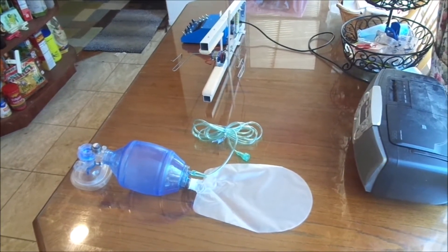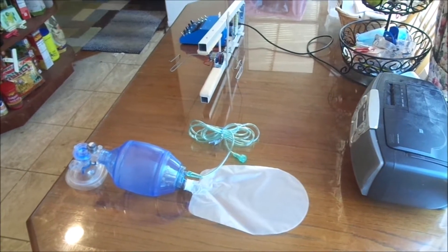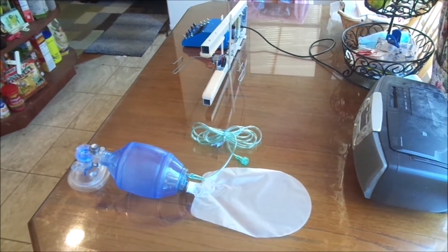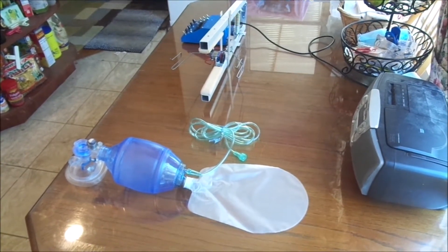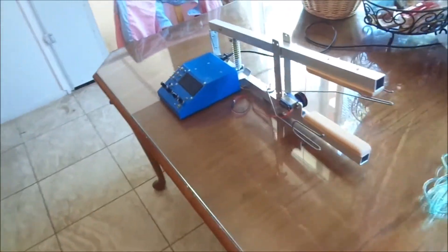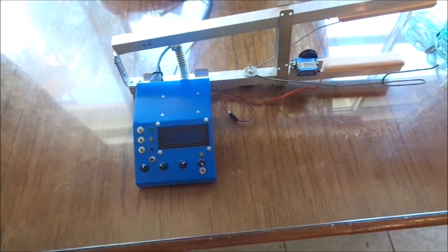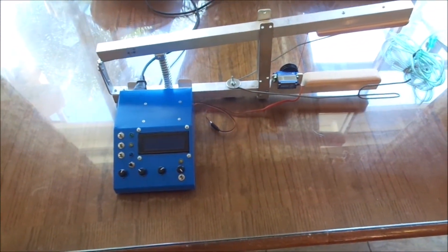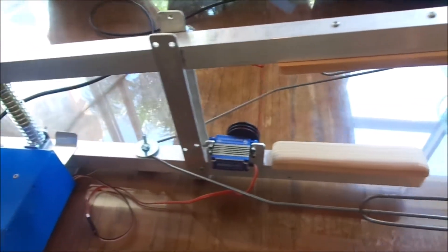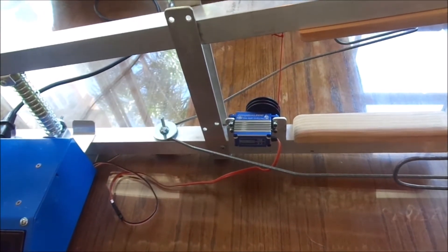There's the BVM unit — bag valve mask, or ambu bag. The mechanism squeezes the ambu bag at different rates, whatever you'd like to program it for. The doctor pretty much decides that. It operates like a big scissors, but there are wood pads on the ends that hold the bag. It's powered by a very powerful little servo from boats and RC applications.